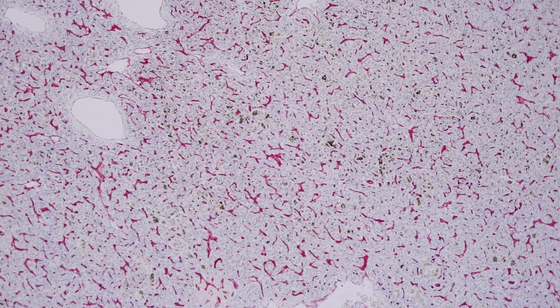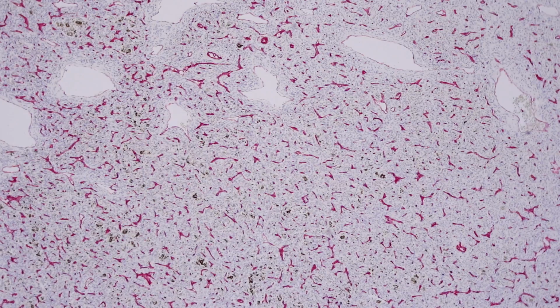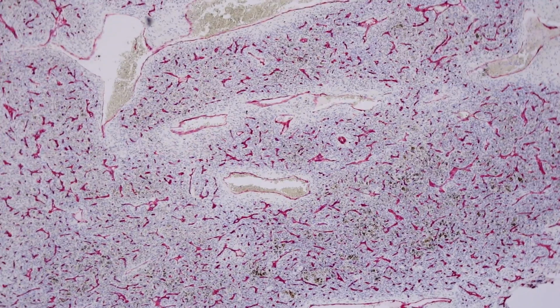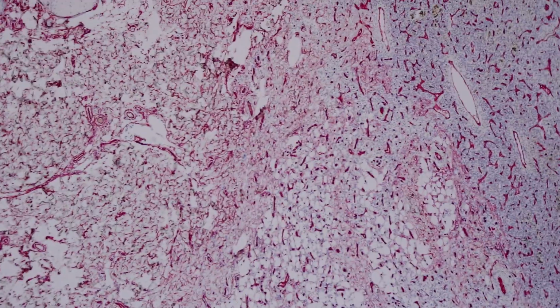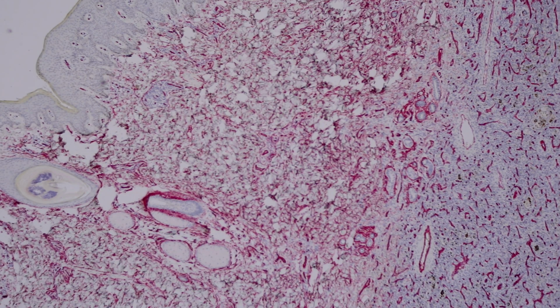With practice on H&E, the vast majority of dermatofibromas and DFSP can be sorted out from one another without even using immunostains most of the time. Okay? But there is a time and a place for it, and this is an example of when it works perfectly. It's completely negative CD34 in the tumor cells, normal positive staining in the surrounding dermis, and particularly accentuated near the edge of the tumor itself.